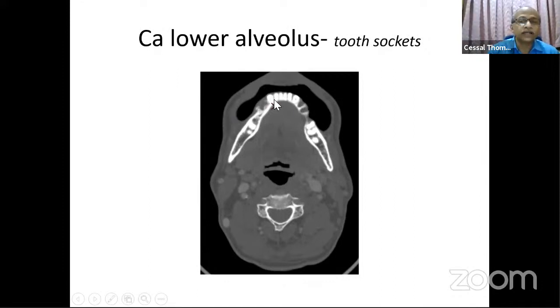But on the other side here, I can see a lesion in the gingiva and see the destruction here. So here I am definite there is destruction because the shape has been changed and in between that bone has been destroyed. So here I am sure, but sometimes again that can produce confusion.